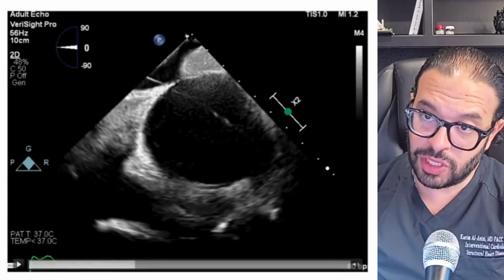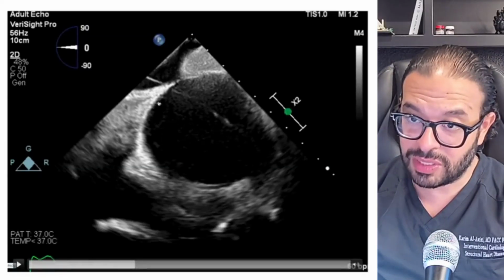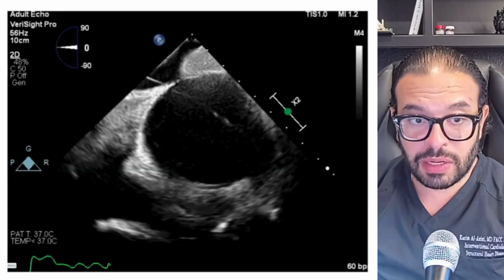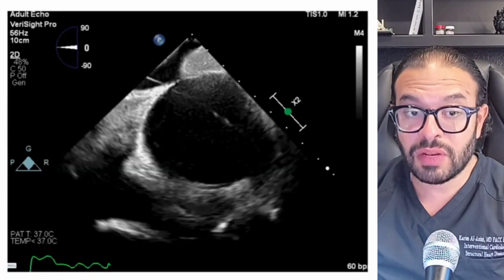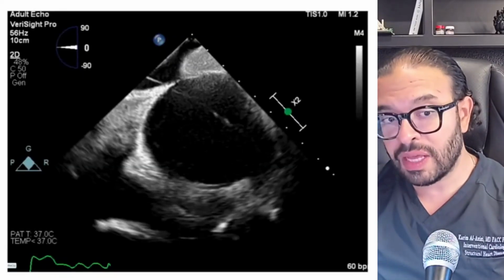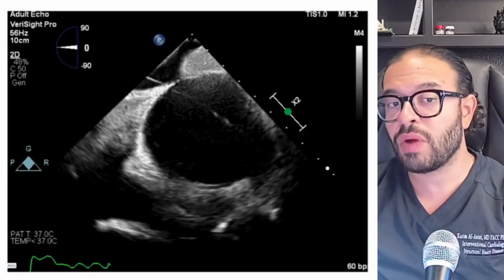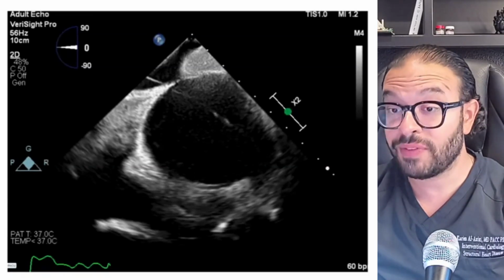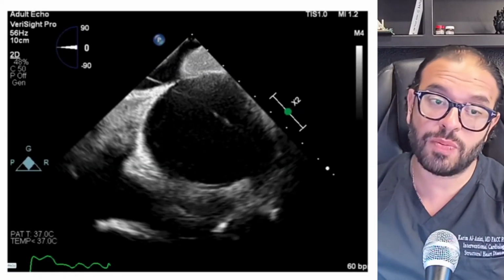So what happens here, as you can tell, we were imaging from the right atrium because you can see the left atrium on the other side, and you can see the transeptal wire and the fossa itself. Once we cross with the wire from the IVC up into the left atrium, we use the delivery sheath to floss on that wire, in order to make the septostomy in the interatrial septum a little bigger. And the reason why we do this is because we want to actually pass our ice catheter into the left atrium in order to give you direct visualization of that left atrial appendage as you perform the procedure.